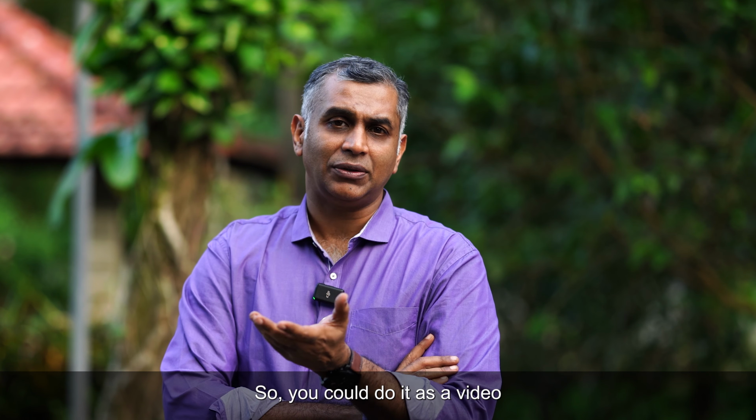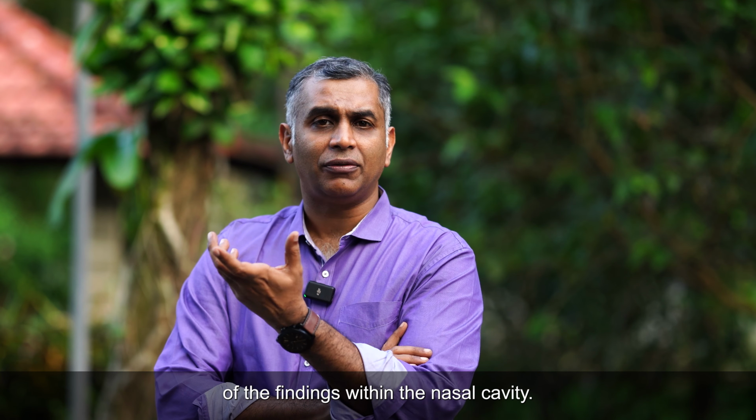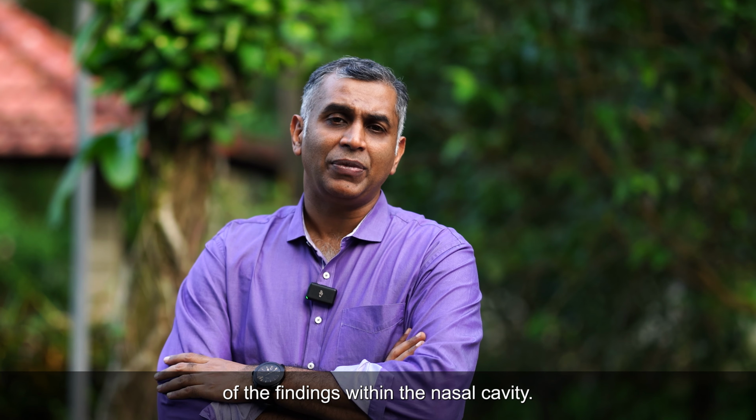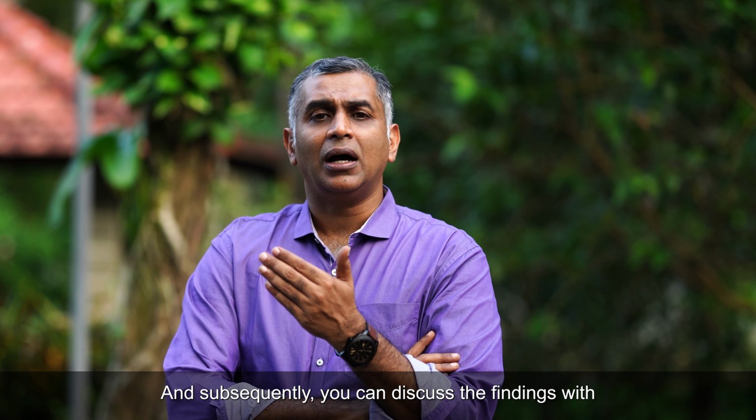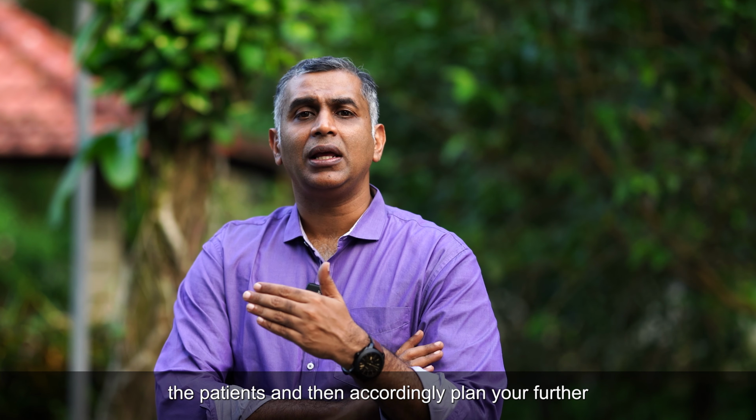So you could do it as a video recording, or you could even take snaps, clicks of the findings within the nasal cavity, and subsequently you can discuss the findings with the patients and then accordingly plan your further course of management.